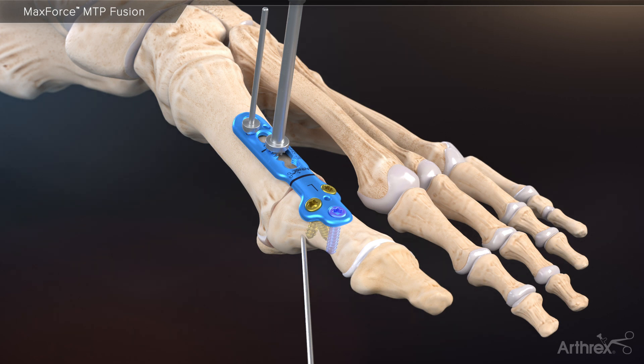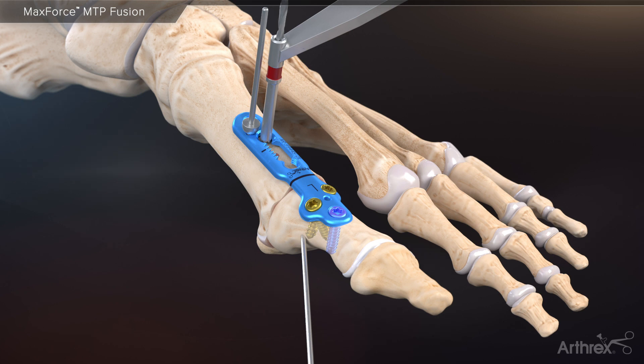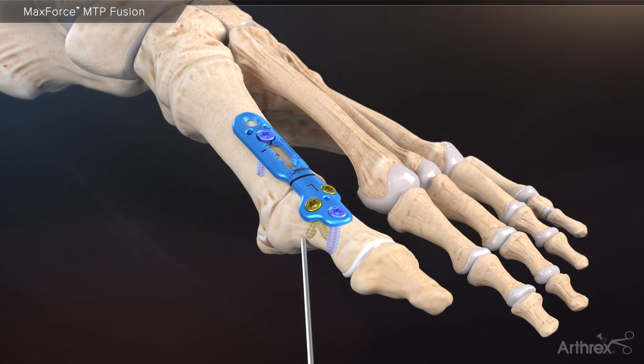With the compression maintained through the BB tacks, remove the compression tool from the plate and proceed to drill an eccentric bone tunnel in the compression slot of the plate. Advance a 3.0 millimeter flathead cortical screw until the head of the screw contacts the MaxForce plate. Remove the BB tacks and fully insert the screw into the plate. This allows for an additional 9 pounds of compression across the arthrodesis site.